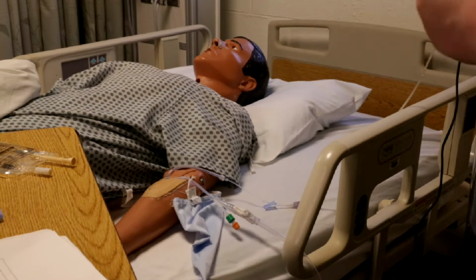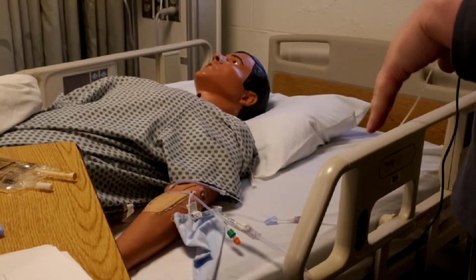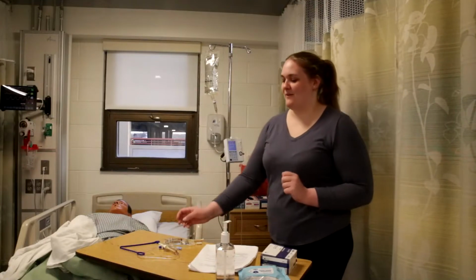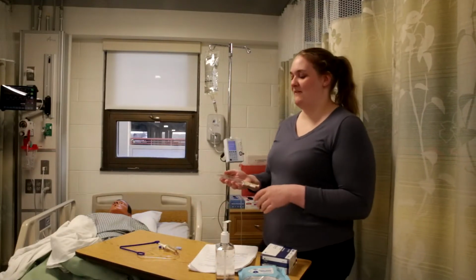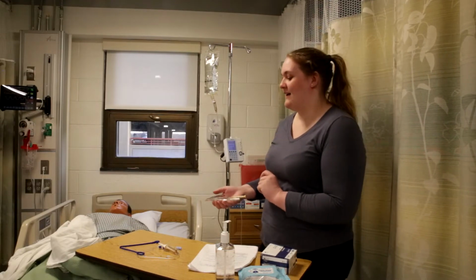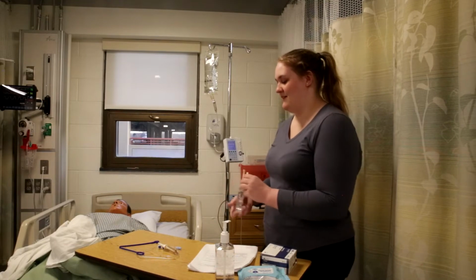Before I start with my piggyback, I'm just going to program the pump because now I have an order to change from the gtt per minute to 30 mLs per hour. So now I'm going to get ready to hang my piggyback fluid, my vancomycin. I already checked for compatibility with the sodium chloride, and it's compatible. So I'm going to spike this.